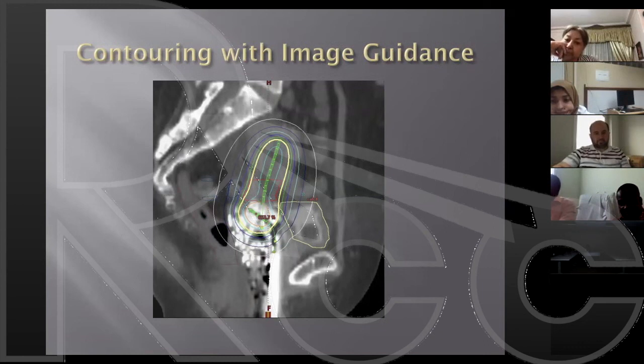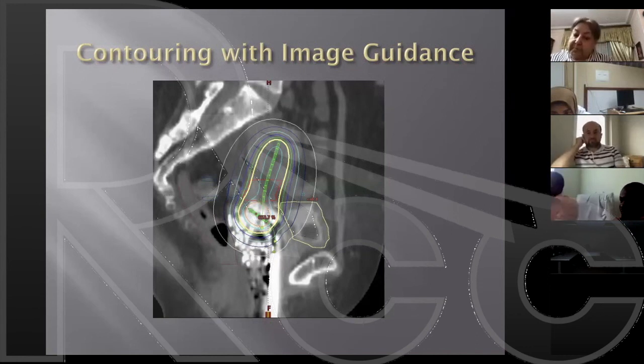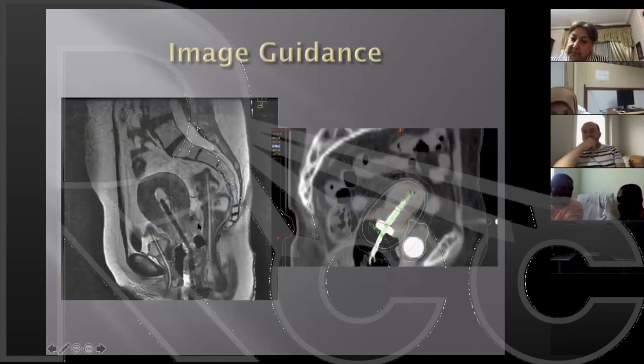Yeah, it's a good question. If a patient has had a great response to external beam, there's limited utility in doing an MRI. You're not going to see very much. So if someone's had a great response, we do not get MRIs. We just get CT planning. If a patient has not had a great response, they still have some parametrial disease or gross disease that you can see or feel, we incorporate a single MRI scan either immediately prior to brachytherapy or with the brachytherapy applicators in place. You can see here, I guess this line doesn't show up that well.